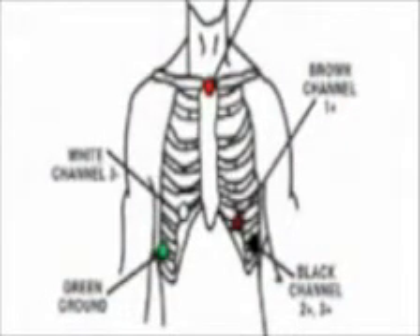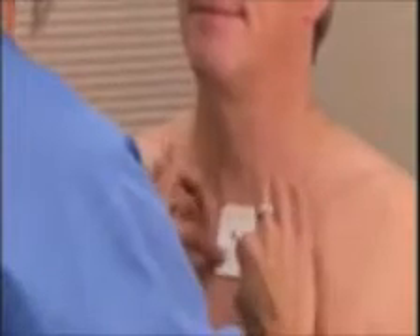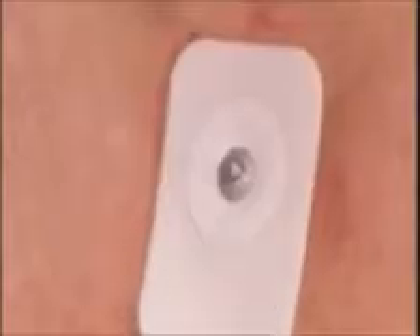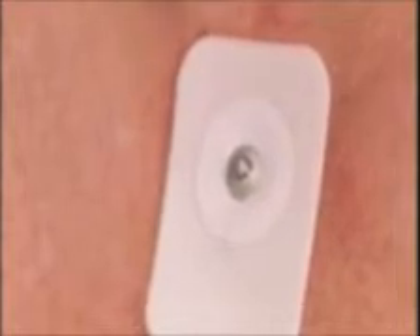If there is deviation from this placement, please make note of it. Once you have placed the electrode, trace the outline of the electrode with your finger, making sure that the gel in the center of each electrode maintains contact with the skin surface. Also, make sure when placing the electrode that it does not wrinkle. Avoid pressing on the center of the electrode as that may disrupt the gel and impede the conduction of the electrical impulses.